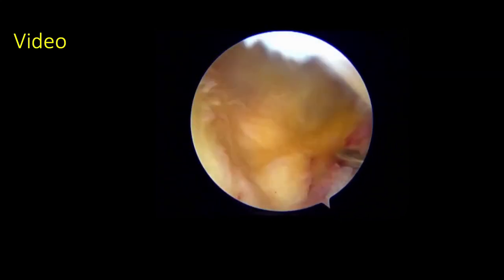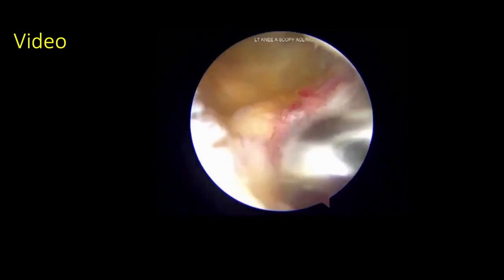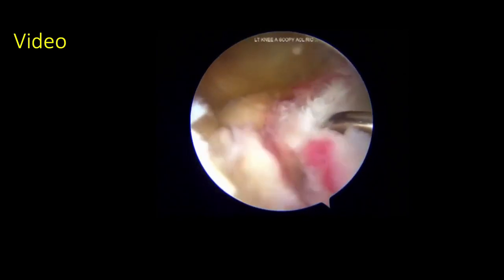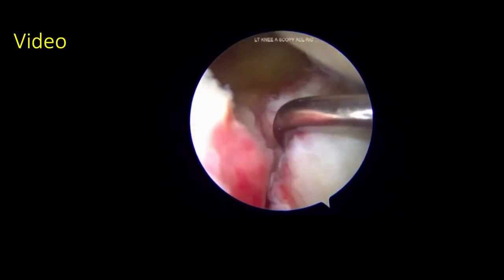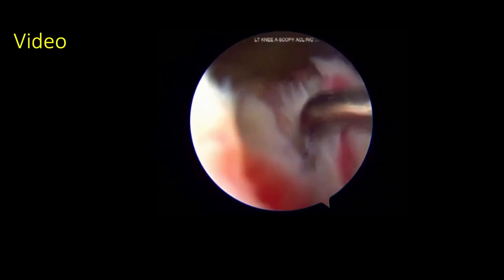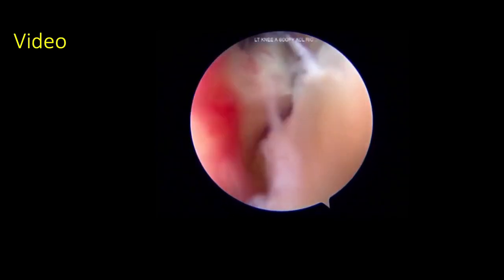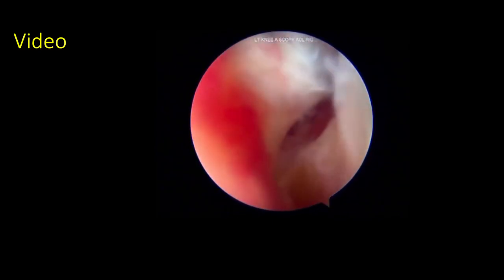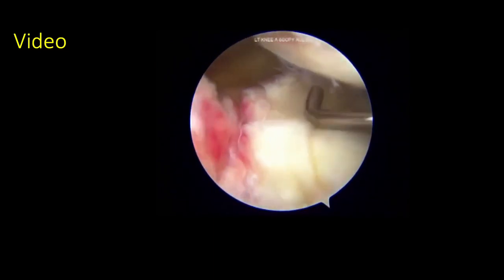The inferior surface of the meniscus is probed to confirm the tear extension on the inferior surface. After planning the repair strategy, an all-inside device is passed over the cannula, with the first suture being placed near the posterior root of the lateral meniscus in the posterolateral capsule.